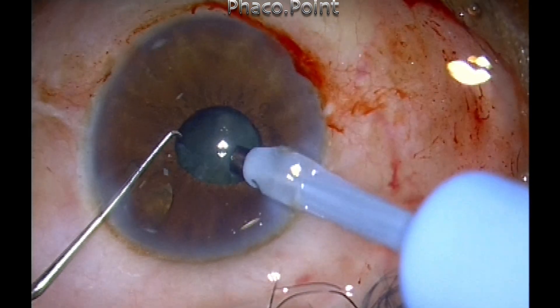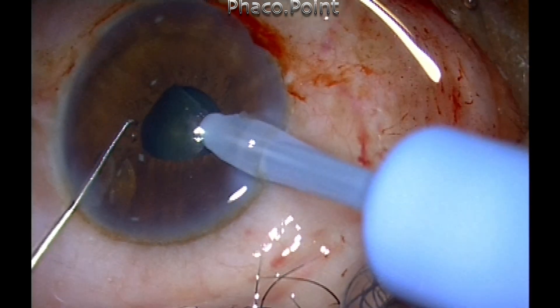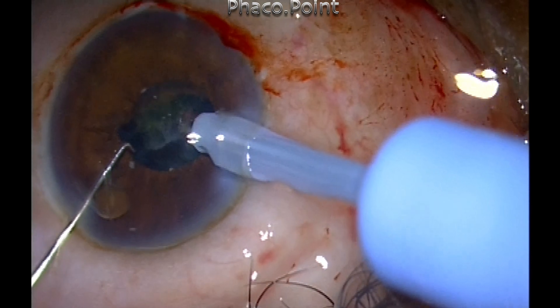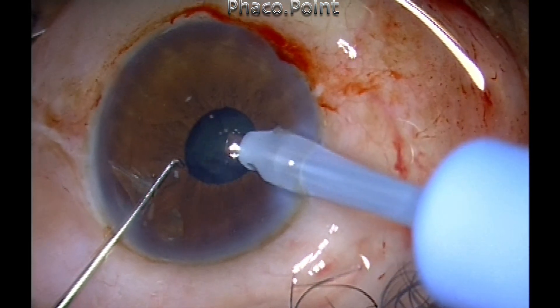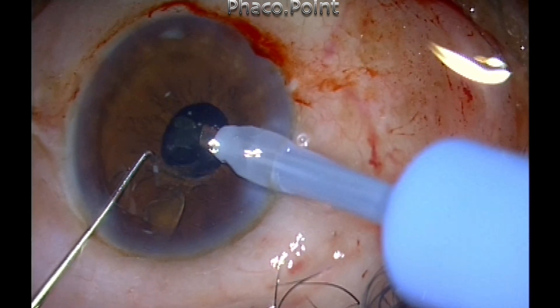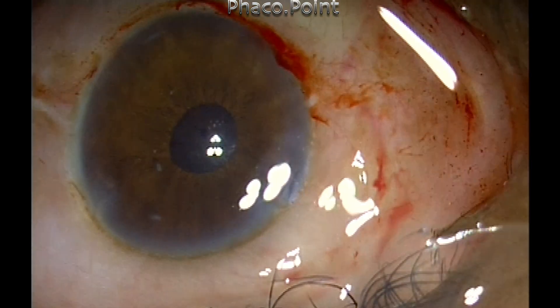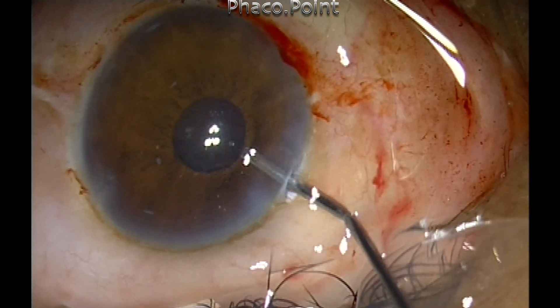Once you impale onto a fragment, if the fragment is large you can make it sit astride the pupil, then emulsify this piece in the pupillary plane giving very short bursts of phaco power and using to a large extent just vacuum — in order to emulsify the pieces in a systematic fashion, taking advantage of phaco dynamics and getting the entire nucleus out. The pupil, you will admit, was seldom more than 2.5 to 3 millimeters throughout the entire procedure.